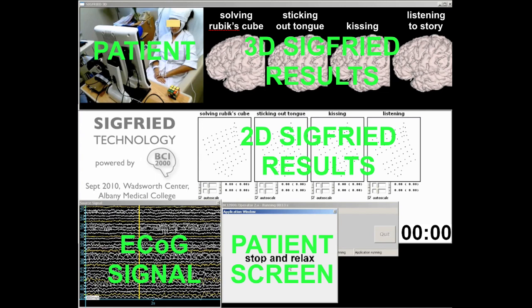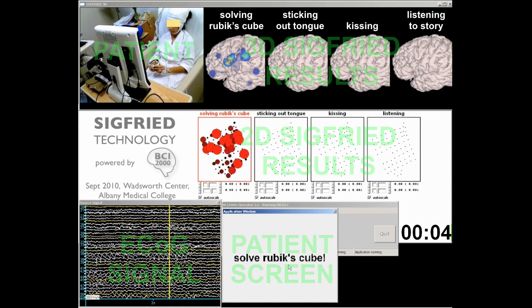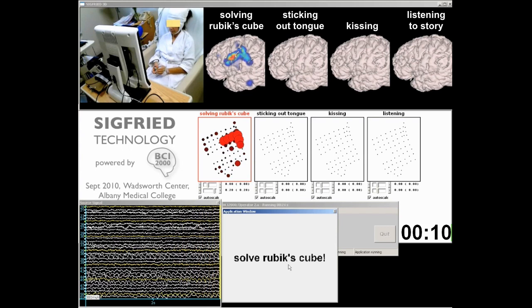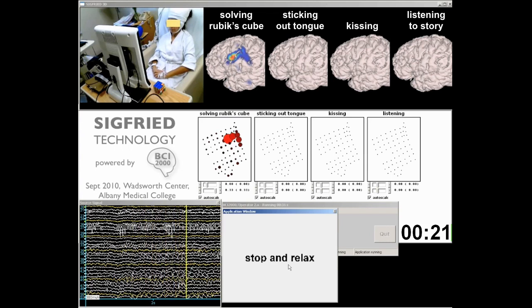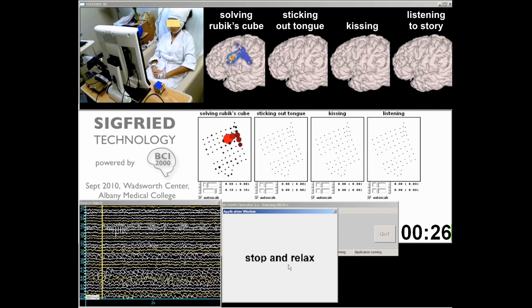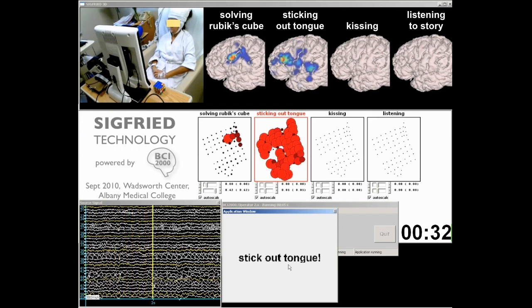And in contrast to that stimulation mapping we saw, which takes, again, 3 to 8 hours, sometimes over 2 days, we can ask a patient to perform a behavior like hand motor, and within seconds, we localize that activity precisely on the cortical surface. At the time, this solution was absolutely over-engineered. It doesn't even need to take as long as it took then, which all said and done was about 12.5 minutes to dissociate these 4 different areas of sensory motor function.